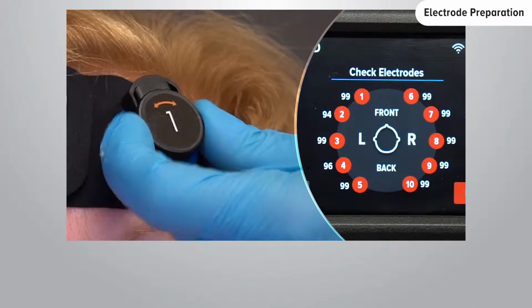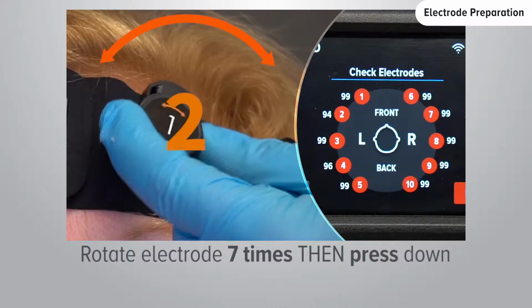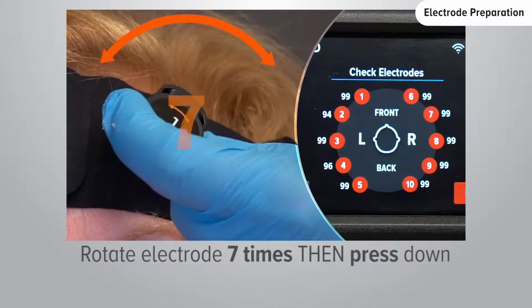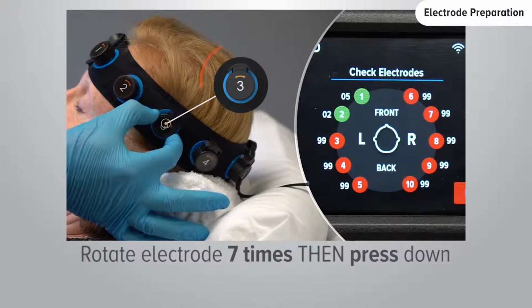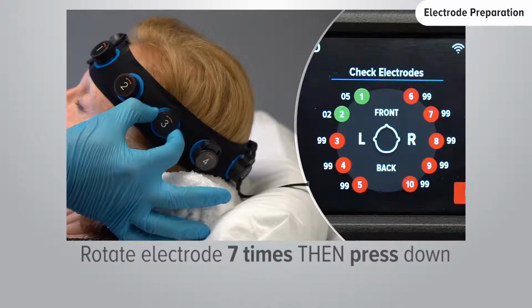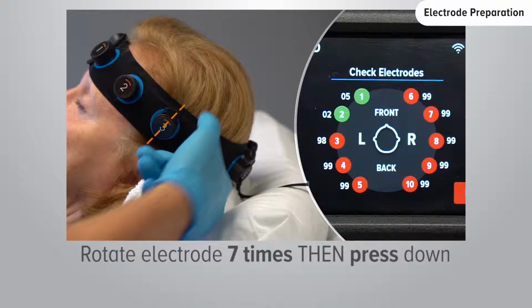To prepare the electrodes, you need to rotate and then squeeze. Rotate the electrode knobs back and forth for 7 complete rotations. 1 complete rotation consists of both the clockwise and counterclockwise turns. This allows the electrode to part the hair and clean the scalp, so be sure to apply gentle pressure towards the patient's head during the rotations. After 7 complete rotations, return the electrode to the upright position.